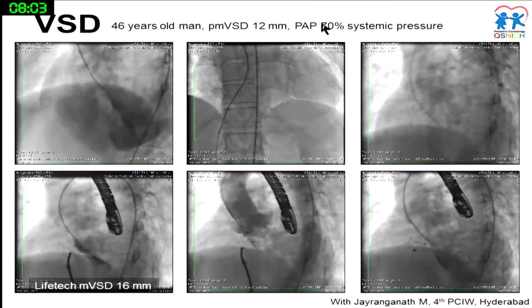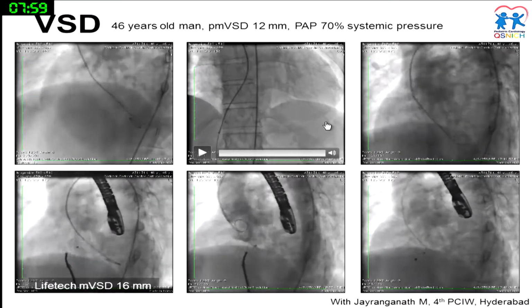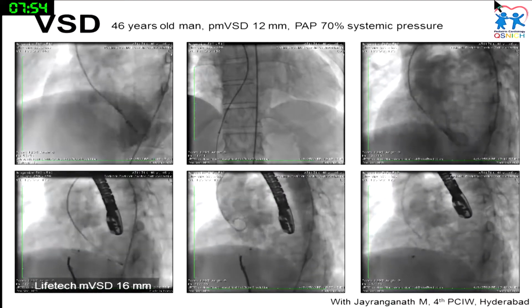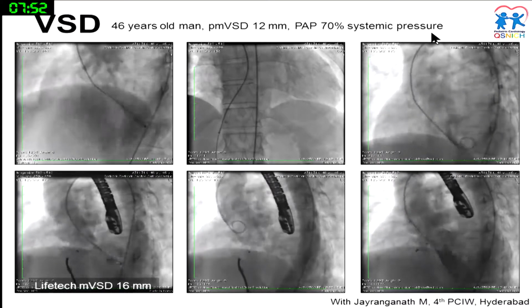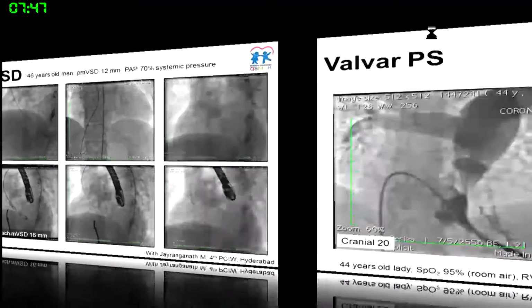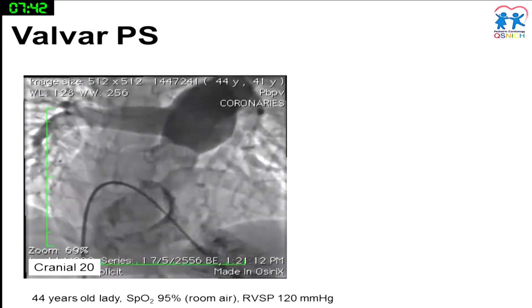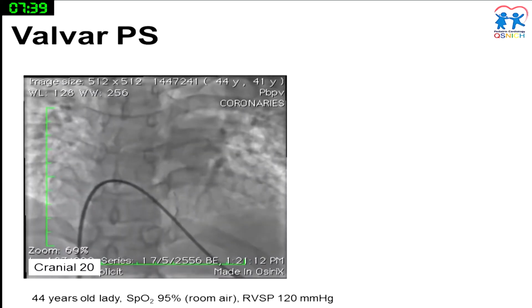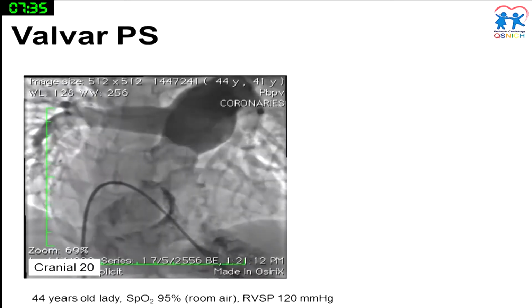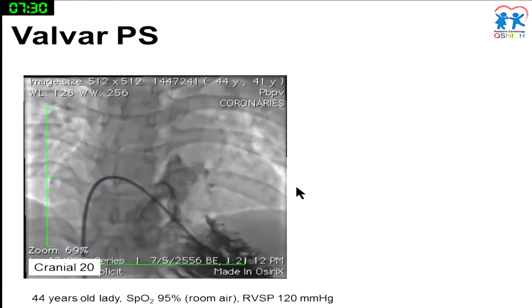percutaneously without surgical treatment. Well, again, it's not feasible in all the cases, but just to show you that sometimes it's not that easy, and sometimes this is also the thing that we can consider to do. And also, I don't know in your country, but in my country, we still have 40 years old man or lady, or 60 years old with severe valvular PS like this. So as you can see, very, very severe.